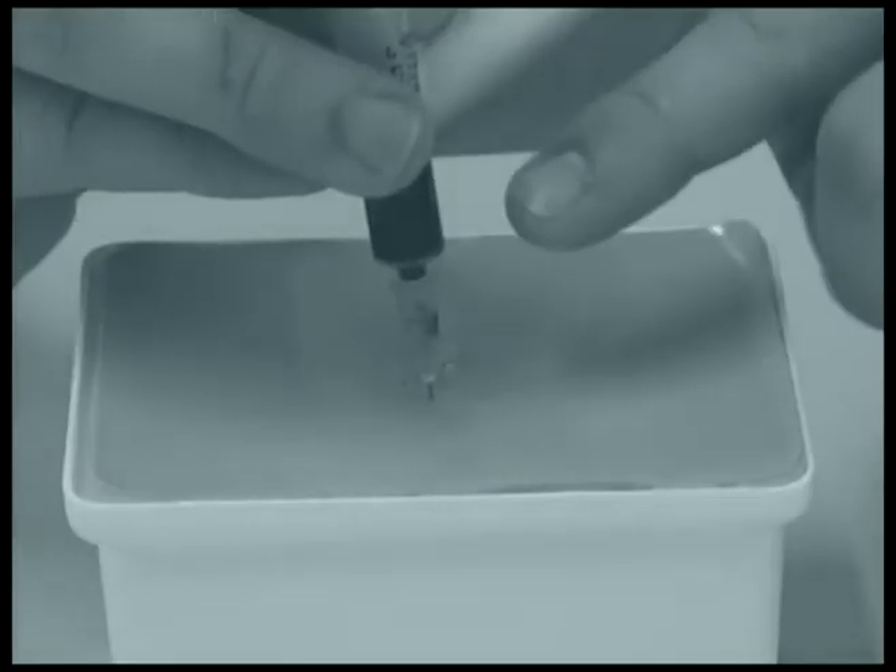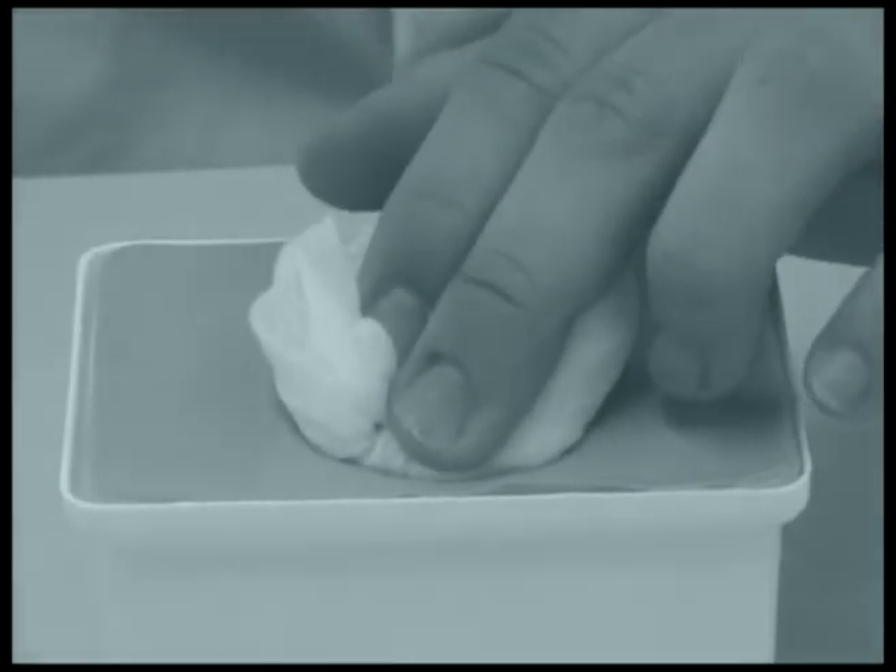If blood is aspirated, you've hit a vessel. Withdraw completely, replace the needle, and attempt the procedure again.